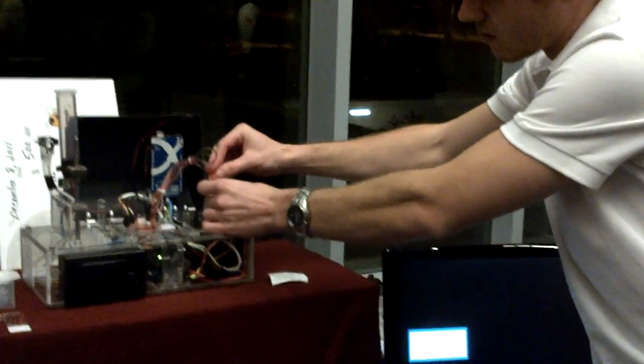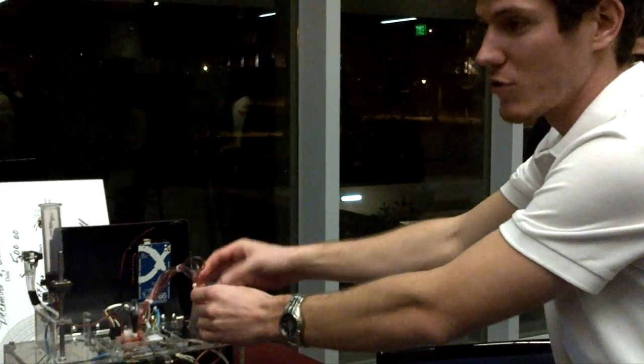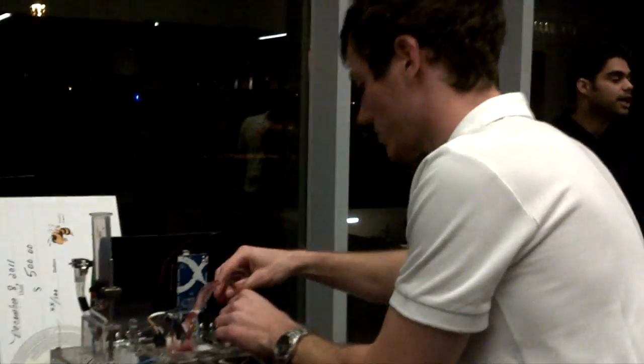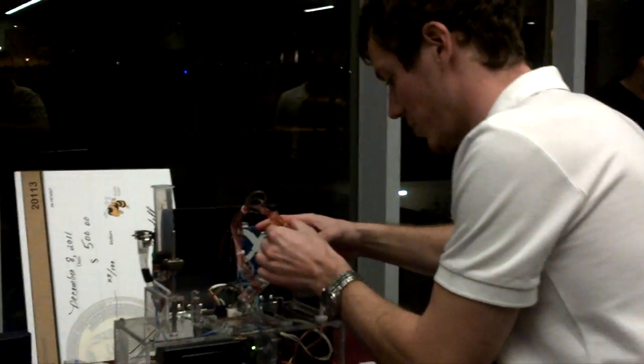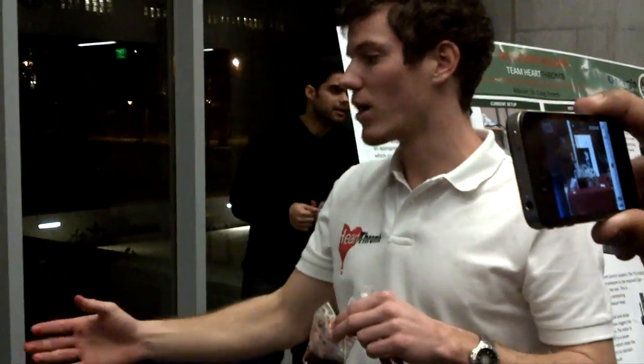We'll place this cap back onto this to seal the blood bag, so blood won't spill everywhere when you take it out. So move the chip out first. Lift out the blood bag. Lift out the syringe, which will be empty by this point in time, and then you can throw all of this into the hazardous waste and the machine is now ready for the next test.